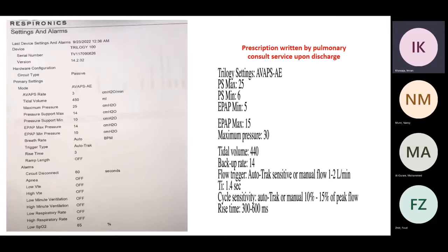But if they know this is my preference, the settings, and you preferred some settings, then you should go with the settings, because when you have put a patient on the vent in the ICU, you determine what you put them on, right? Yes. And even if you tell the respiratory therapist and they have a disagreement, they will discuss it with you, but they will just go with whatever you want them to be on. The same thing is also true here, but actually the prescription wasn't executed.